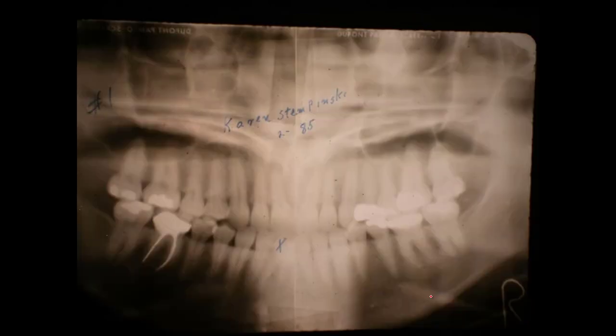Alright, there it was originally, and it left this button sticking out there, you see. So she didn't like that, but I didn't mind it. But if they want it, well, they can do the genioplasty. Now here's, in doing this case, I'll tell you, if she'd had a wisdom tooth back in here, we would have extracted that thing and brought that tooth up and filled that in and bring this one back in here. And if this is bad or they're missing, don't ever pull a wisdom tooth. Bring this forward. We've showed you how to bring the root structure up and parallel it. But somebody had already taken that out, and that's fine. You'll have to take care of this tooth better all your life.